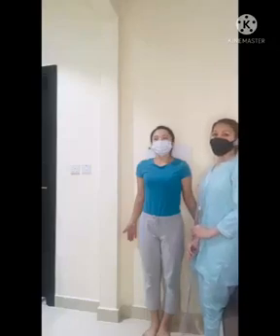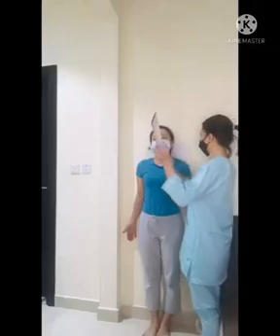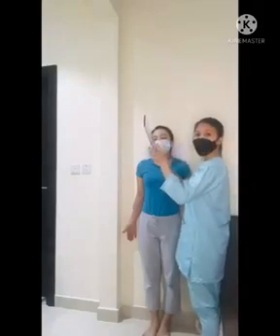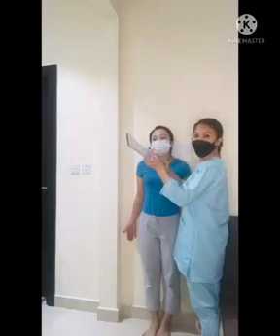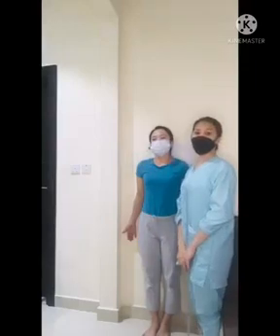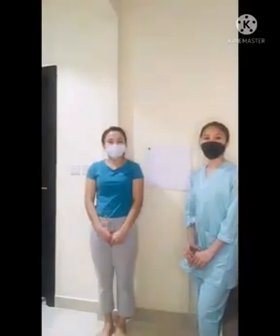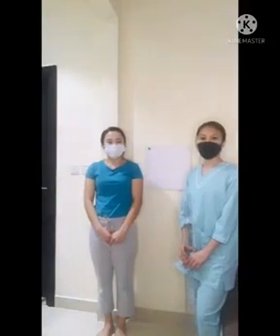So, the central ray in clavicle is to the mid-clavicle. So, the structure shown in this projection is the frontal image of the clavicle. What we're going to do is the AP axial projection, lordotic position.